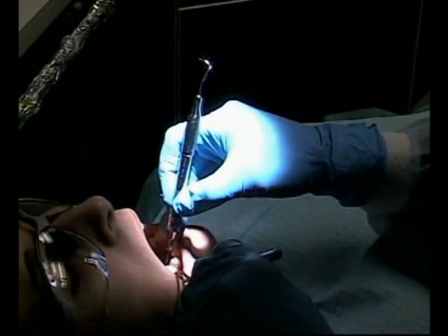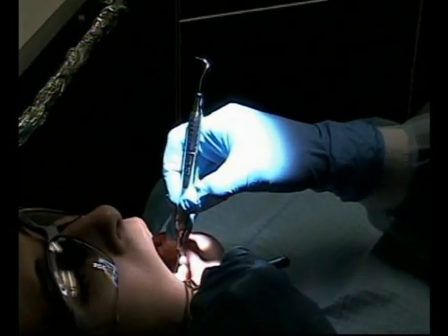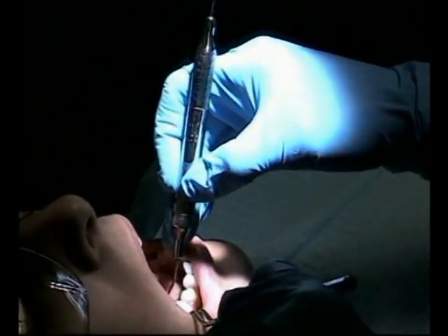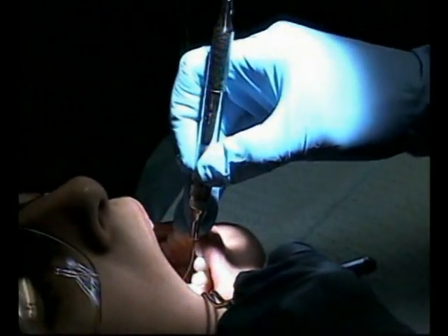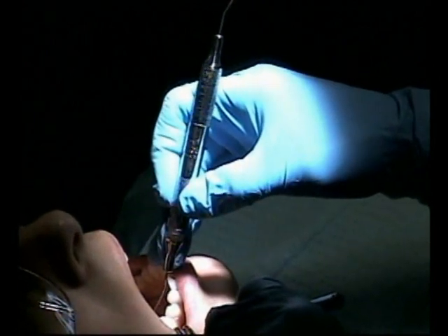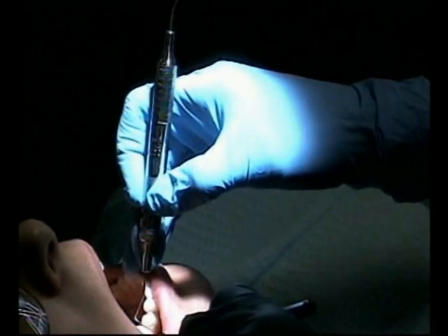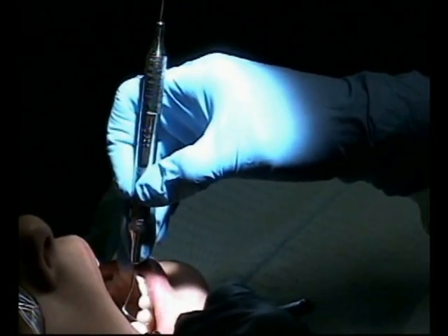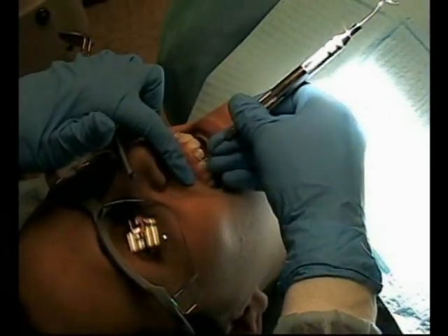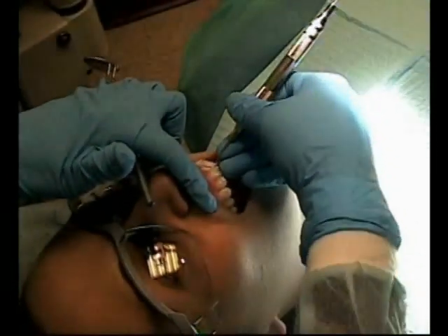Walk it back to the leading edge. At the line angle, come up on the fulcrum a little bit and roll it in. Start at the distal line angle. Walk it to the trailing edge. Come around and roll it in. Oh yeah, nice. Turn your head.